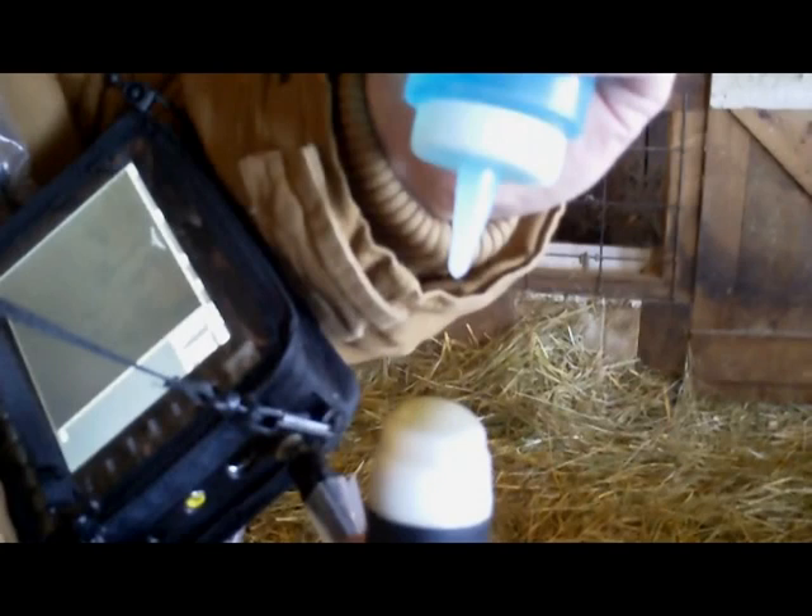When you are ready to scan your first ewe, get the ultrasound ready by strapping it onto your wrist or hanging it from your neck as shown here. It is suggested to hang the ultrasound from your neck so that the hand not holding the probe will be able to activate the freeze button if you are going to measure fetal age.